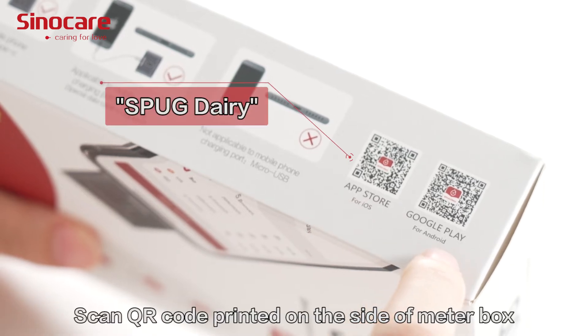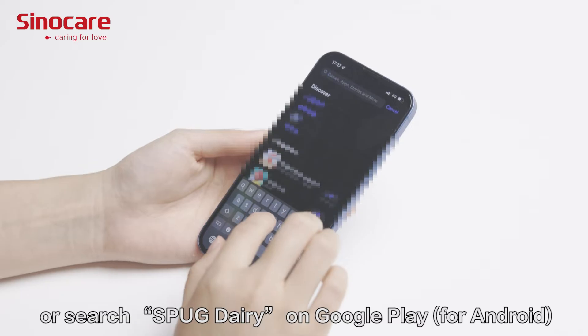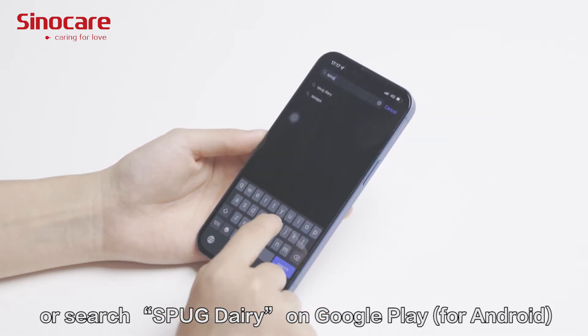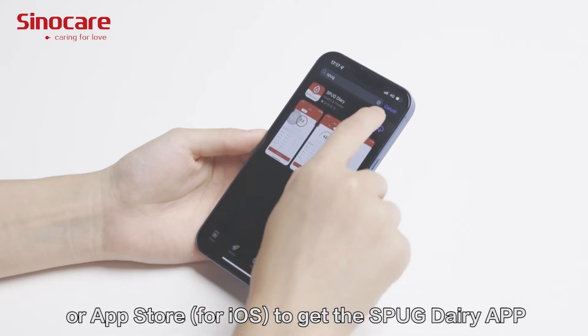Scan the QR code printed on the side of the meter box, or search SPUG Diary on Google Play or the App Store to get the SPUG Diary app.